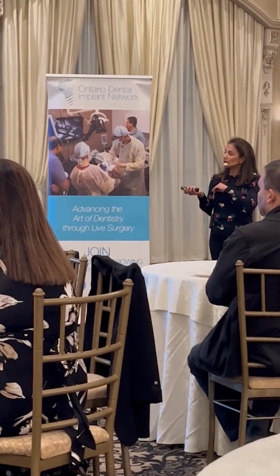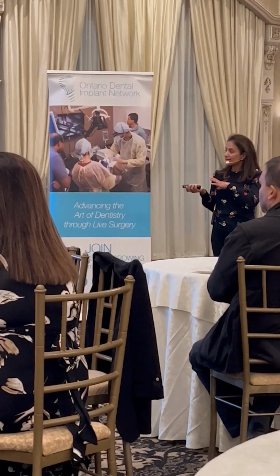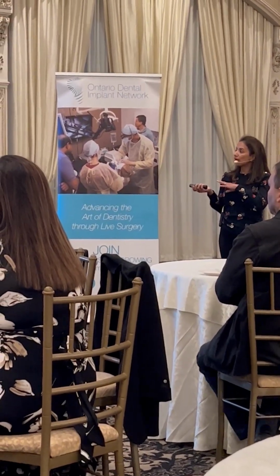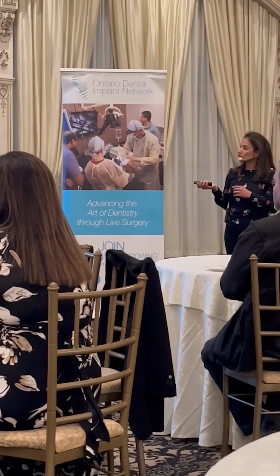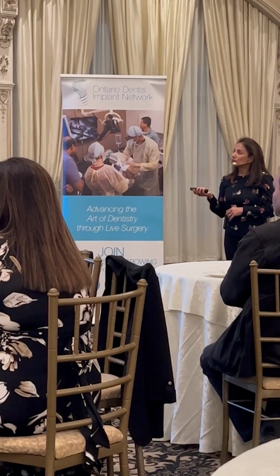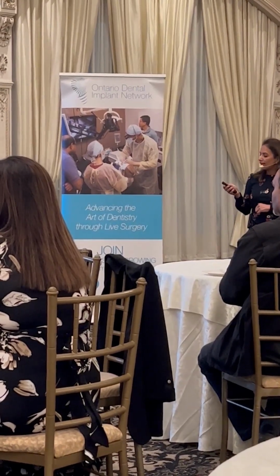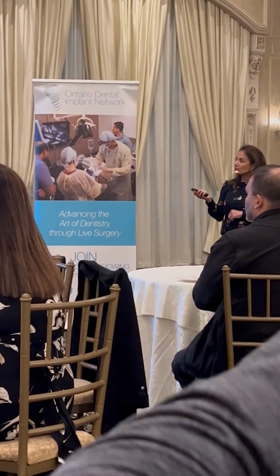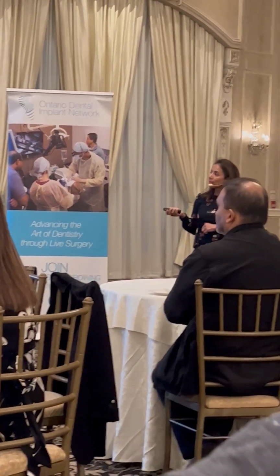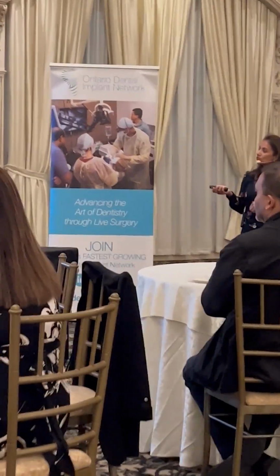1 month later, I like to make sure the site is healing well, they're maintaining oral hygiene, the sutures are removed too, and I usually take an x-ray to just check what's going on with the bone. This is 4 months later when the patient comes in, and I've removed the healing abutment. This is the emergence profile. This is for 3/6 and this is for 3/5. I'm sorry, it's the opposite.